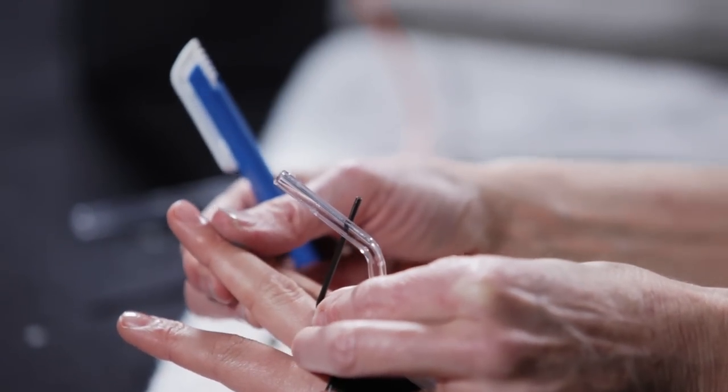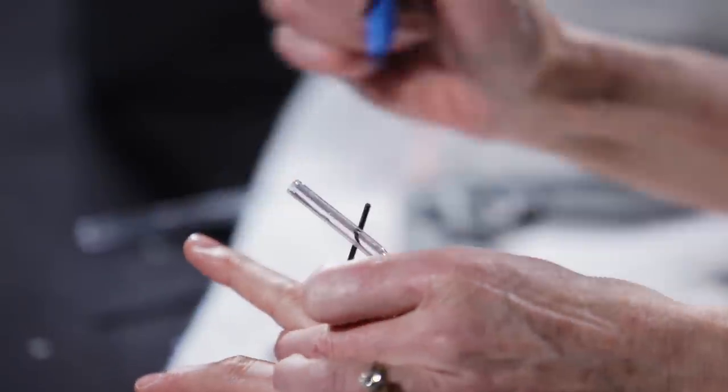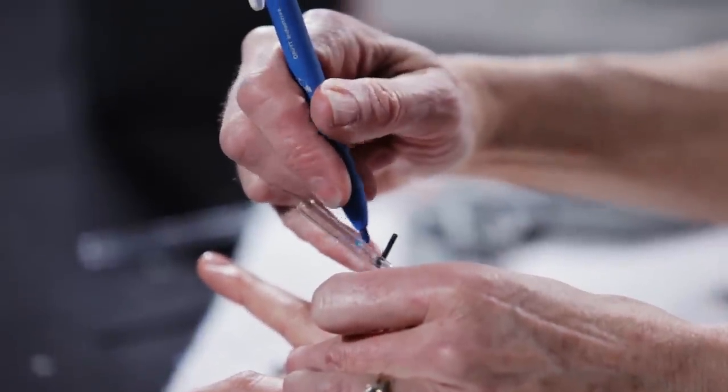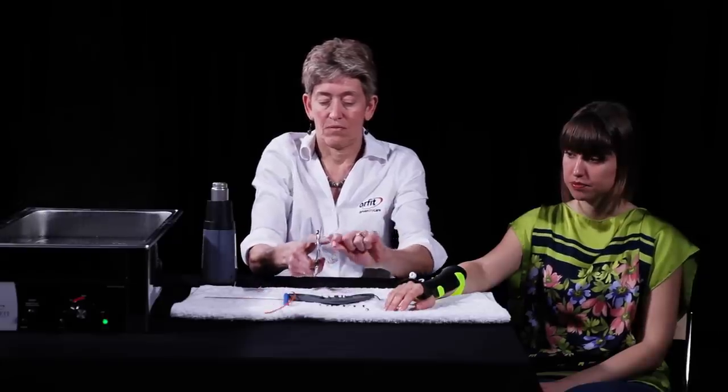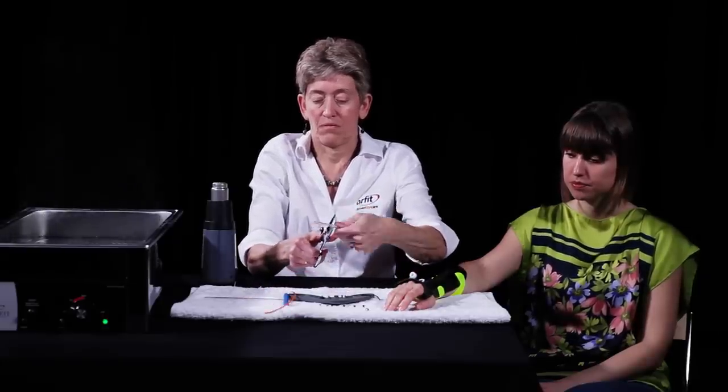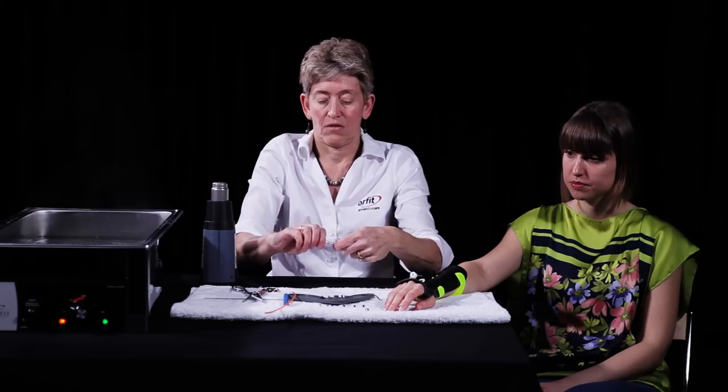Mark the OrphiTube for trimming. Remove the OrphiTube to trim. Carefully score the OrphiTube with scissors and break cleanly at this mark. You can use pliers to do this if needed.